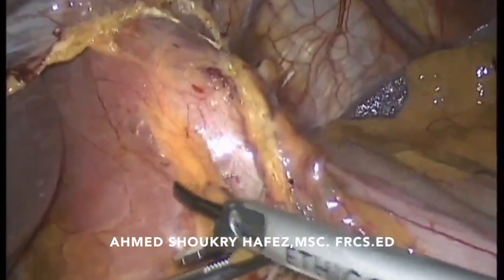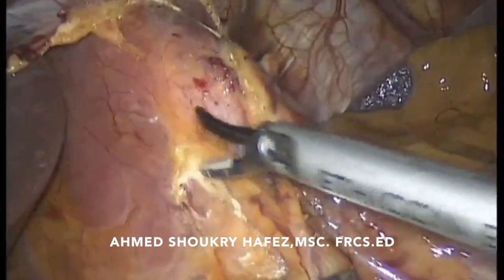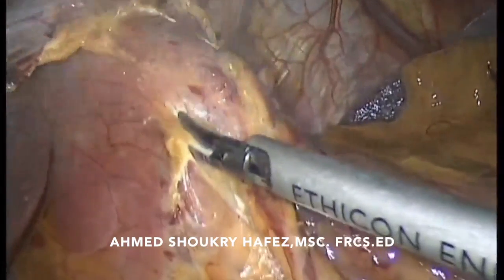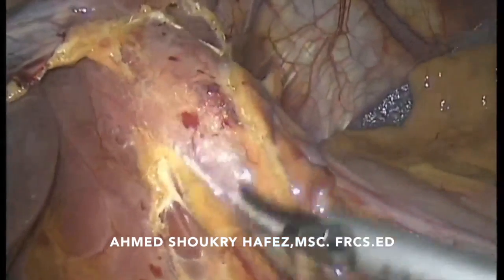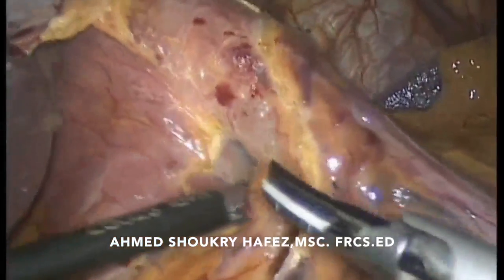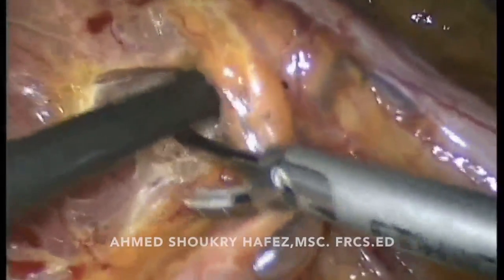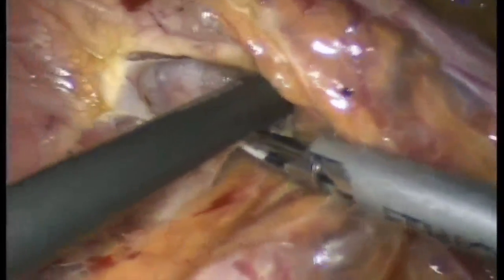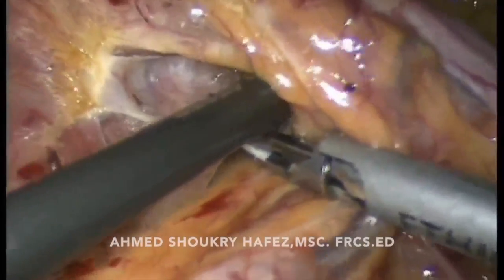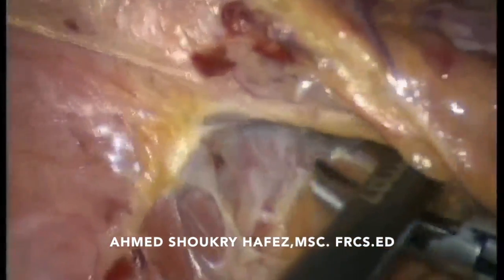We start by opening the peritoneum just above the right crus and be very careful not to deglove the right crus from its peritoneum, as we have said before. The posterior vagus is now into view very clearly, and you have to preserve it and not injure it inadvertently.